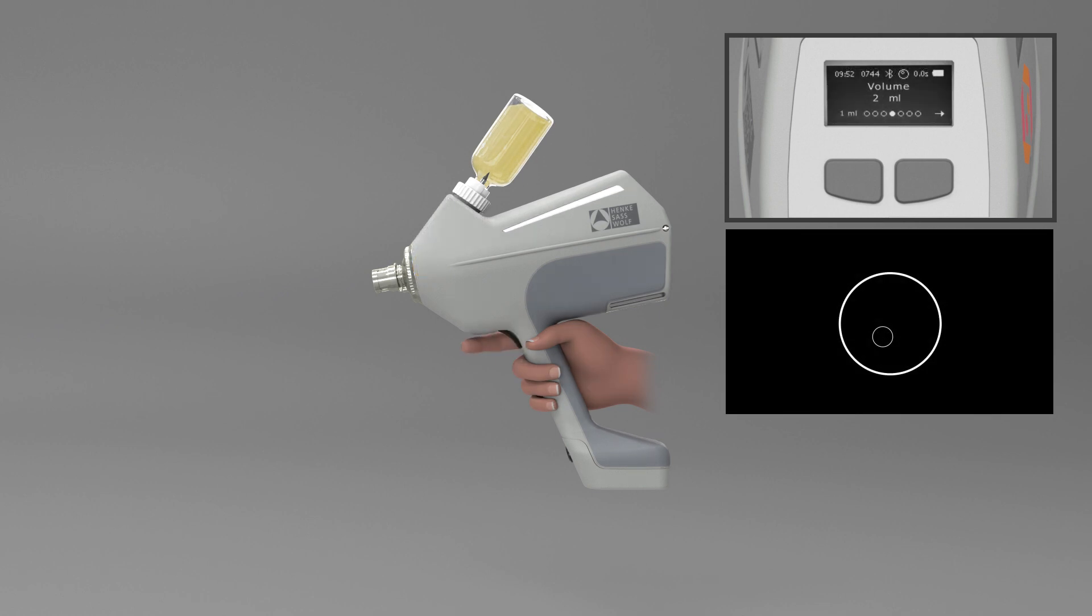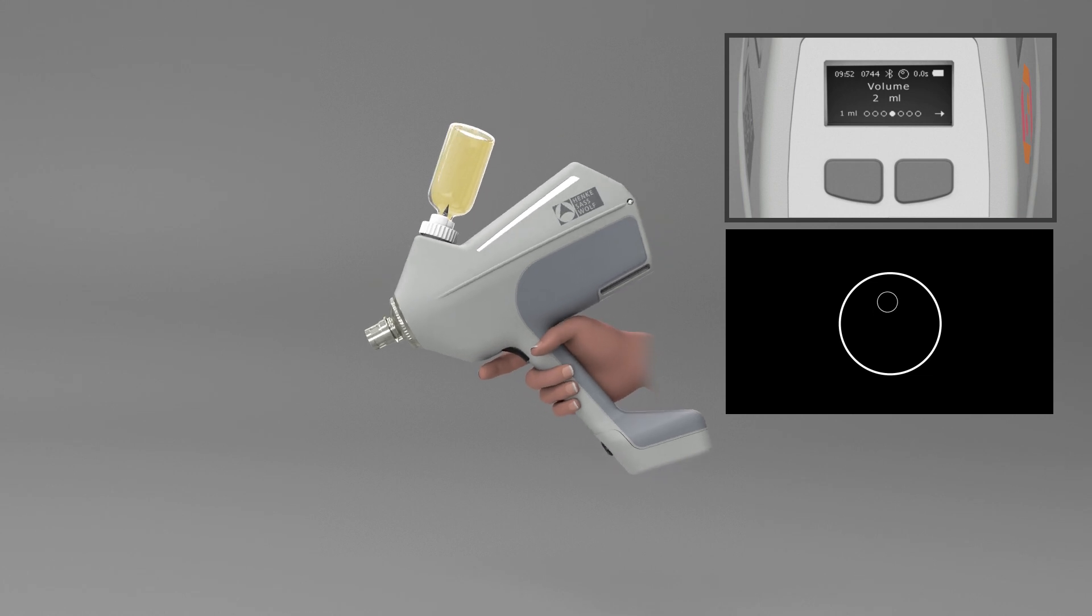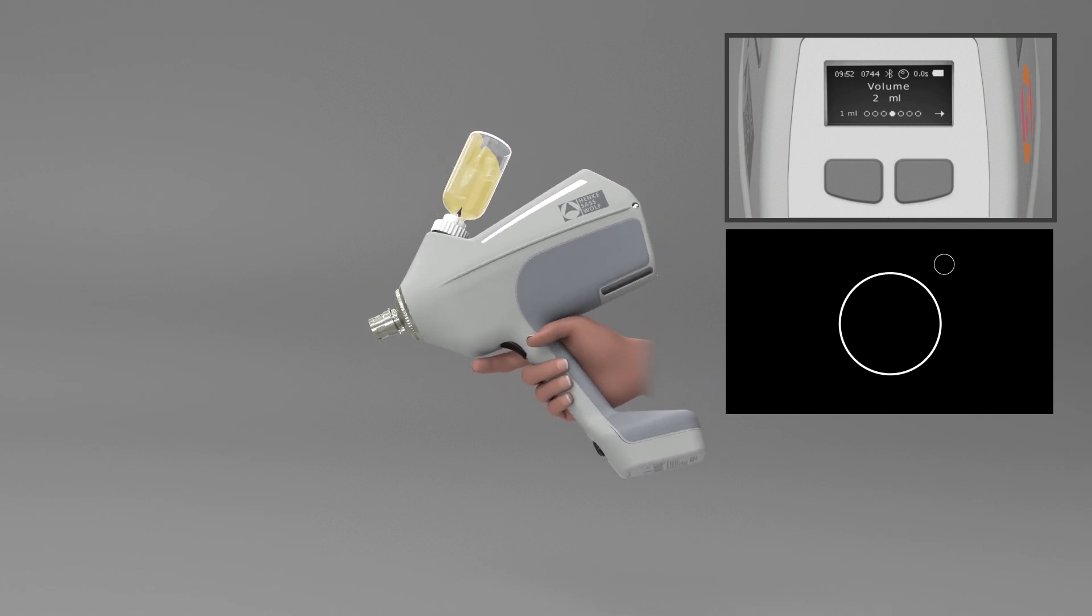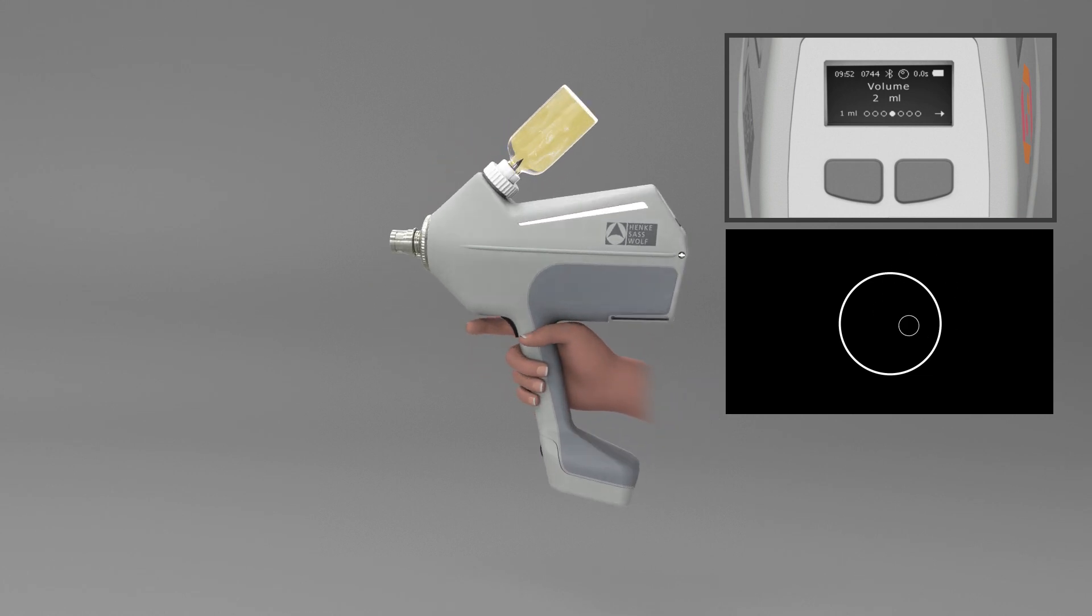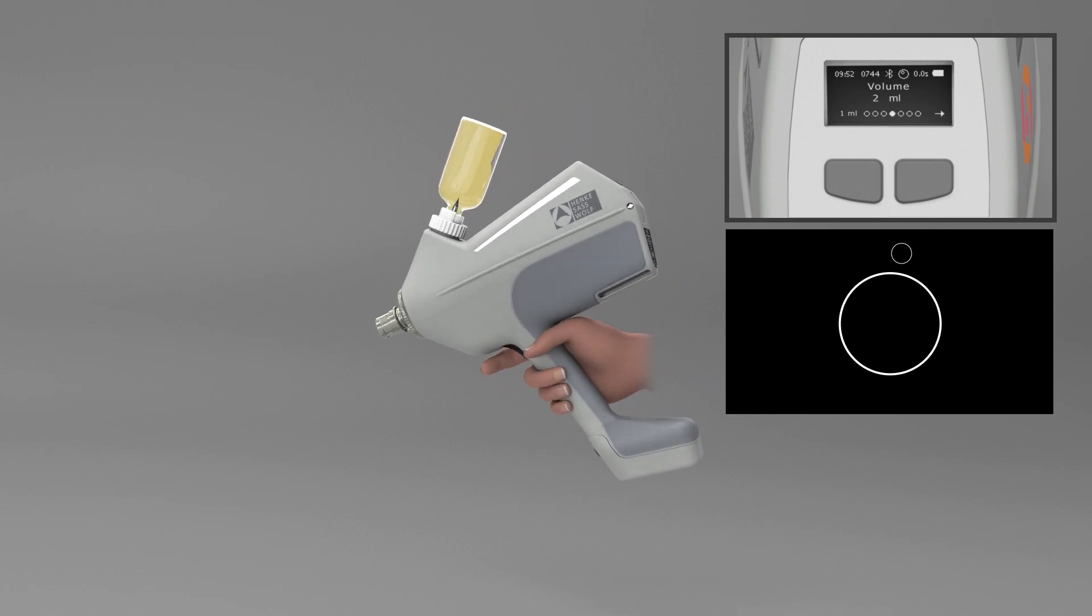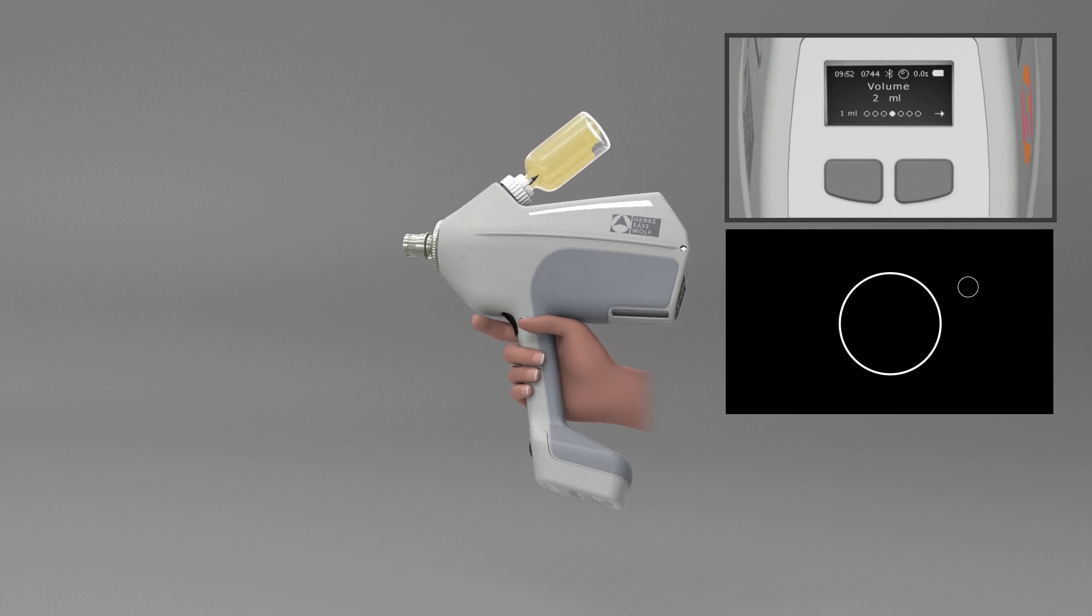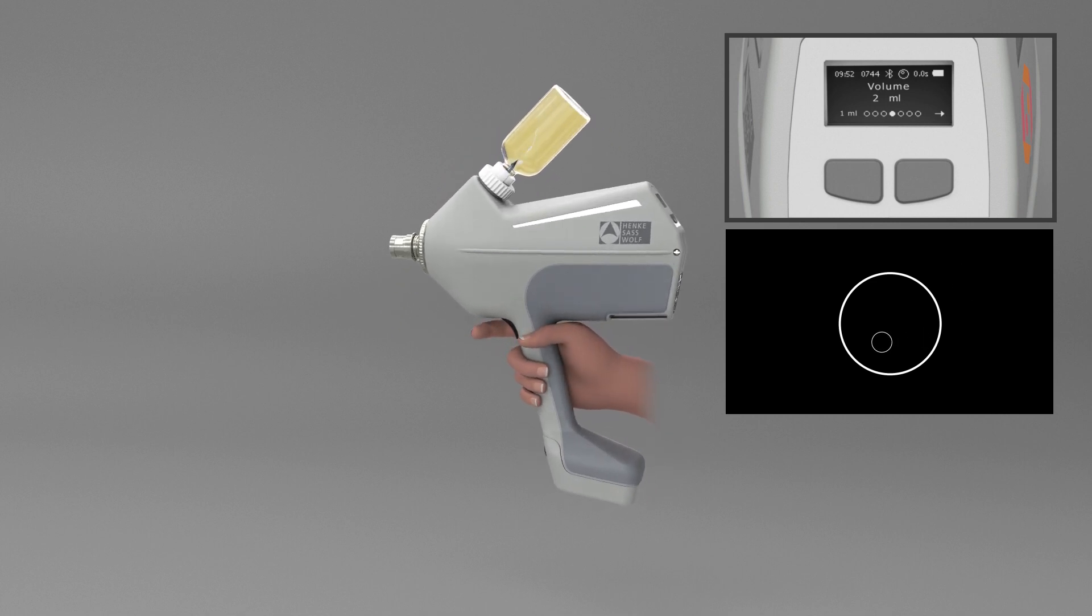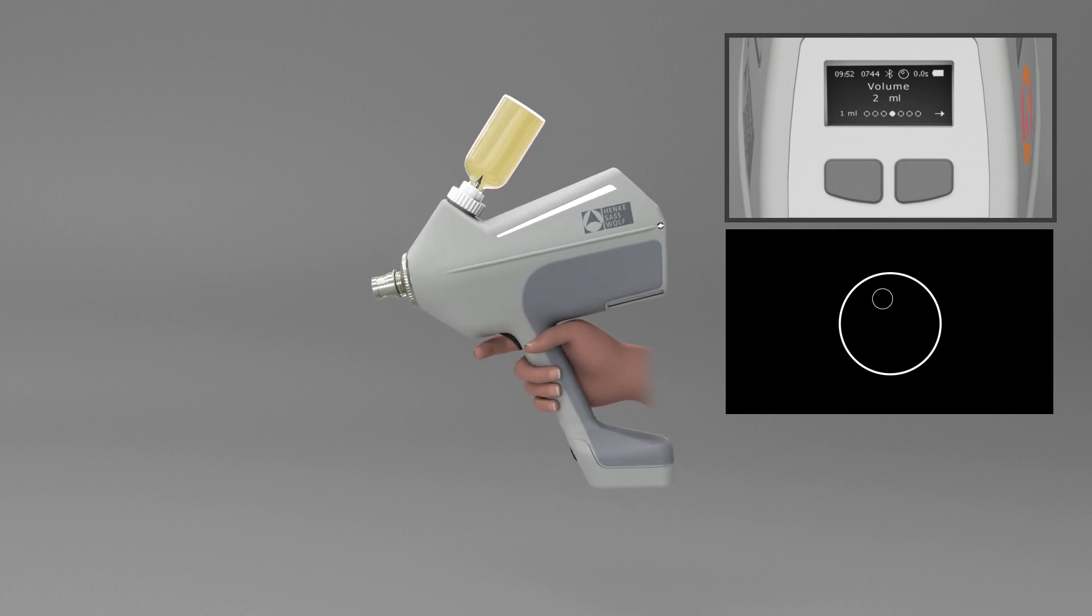The device only allows liquid to be drawn in if it is held at the correct angle. If you move outside the tolerated angle range, the device will alert you.